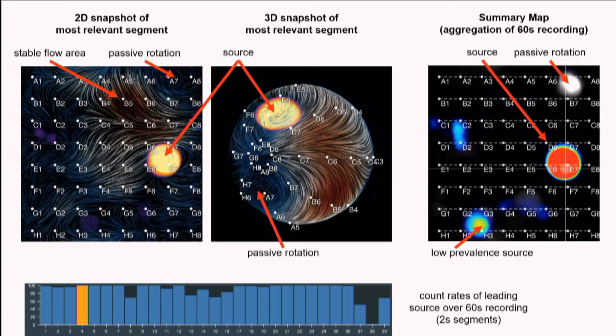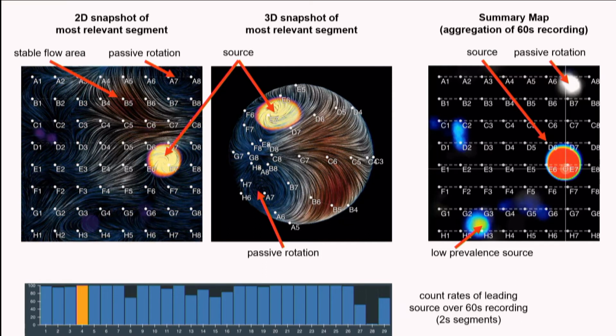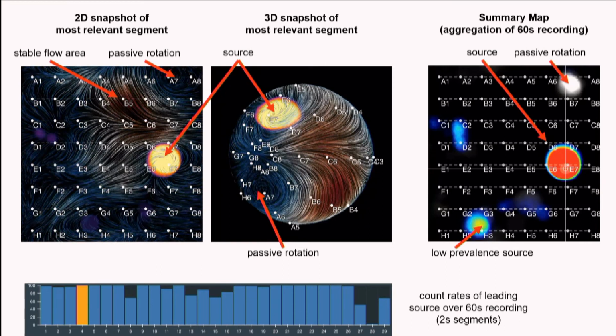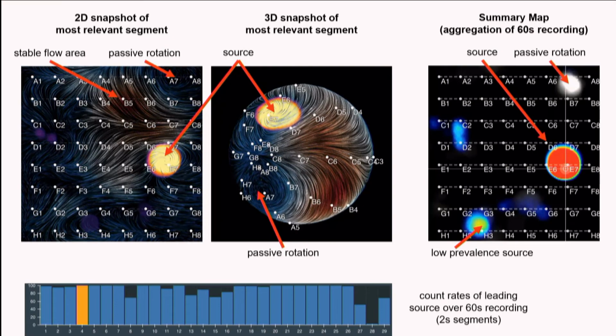The white dot, by the way, is just a passive rotation. On the bottom, those are the individual segments. So if you want, you can look at each of those individual segments to see what's going on, though in reality, what we end up really using is the summary map.